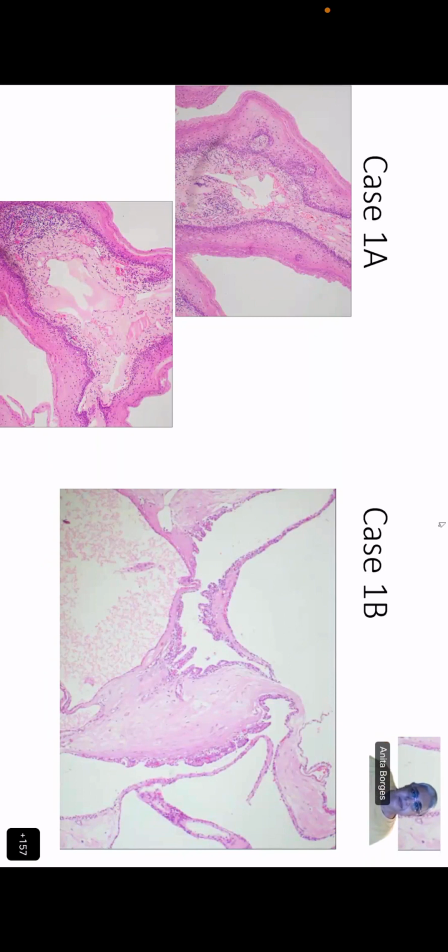Ma'am, first of all, whether it is lined by anything, when there is any cell lining, and the contents of the cyst. Have you told me anything about the lining? Ma'am, lining I'm not sure in this picture. That will be more evident in the higher magnification picture.